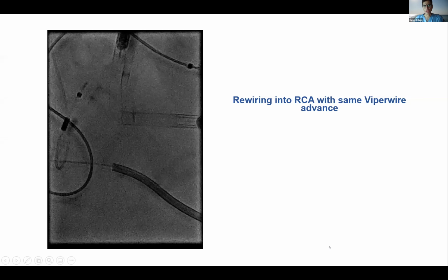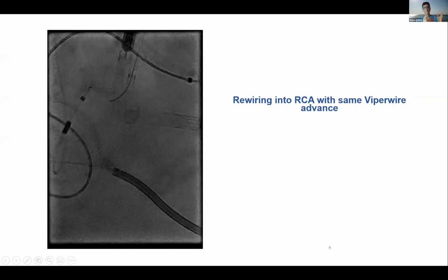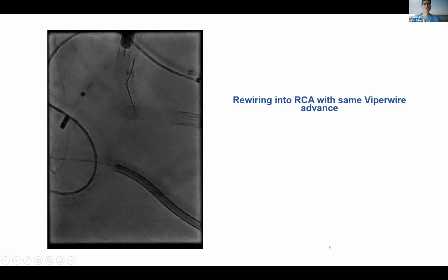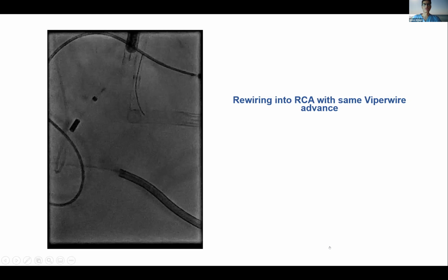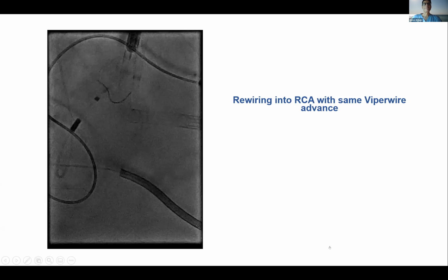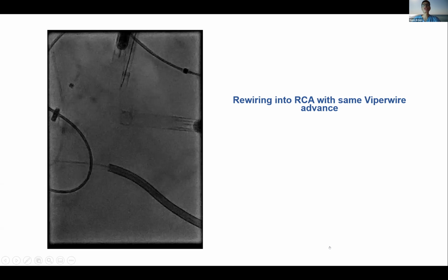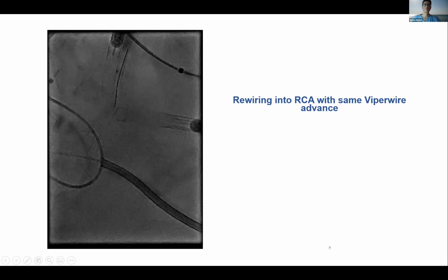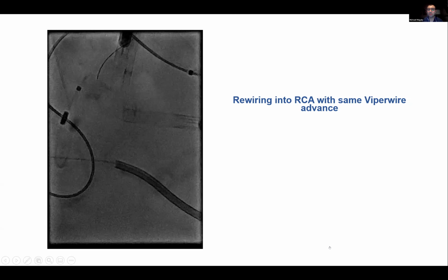Now, I would agree that in your case, you have enough distance, probably not enough disease at the ostium of that other vessel, circumflex, whatever that vessel is, right, coronary, that you're probably okay. And clearly from what you showed us, you really did not have any issues there. Is that right? Yeah, we did not have any issues from that standpoint.